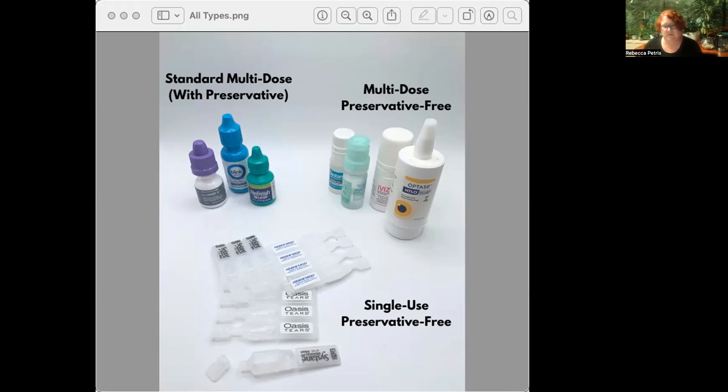When I talk about using them correctly, I mean squeezing out only a small amount. One of the best-kept secrets of eyedrops is you don't actually need a full drop. Your eye surface can only hold about a third of a drop - everything else is feel-good factor and just drains out. So today I want to walk you through all the different types of MDPF bottles and show you which brands of eyedrops use which type of bottle.